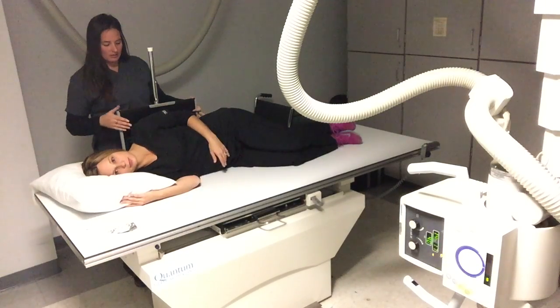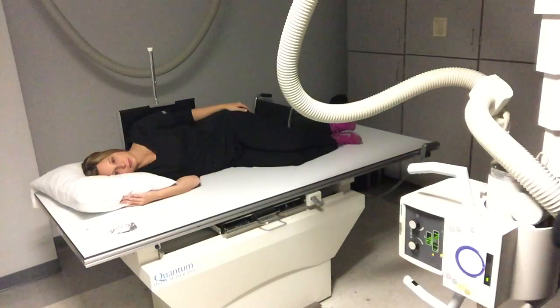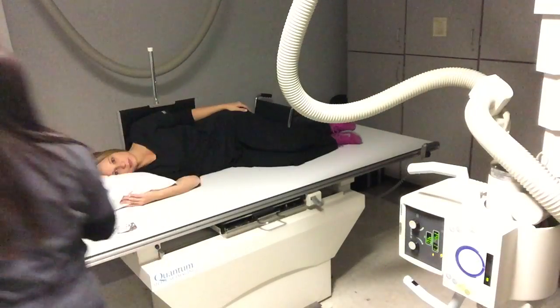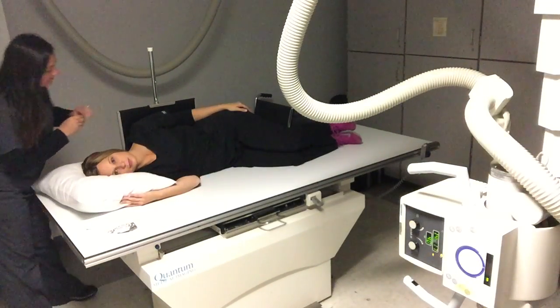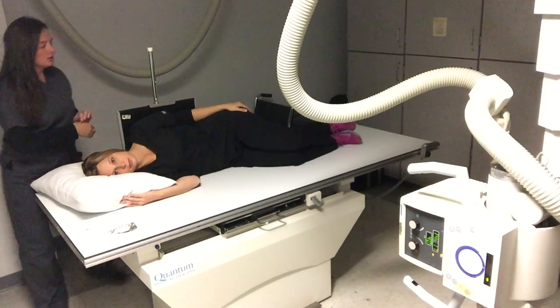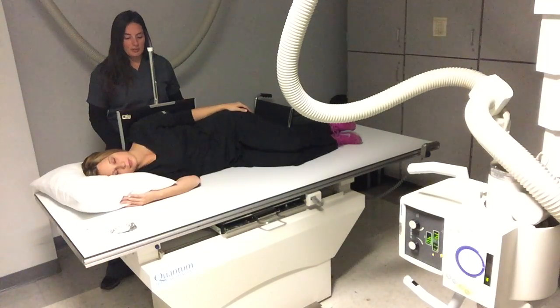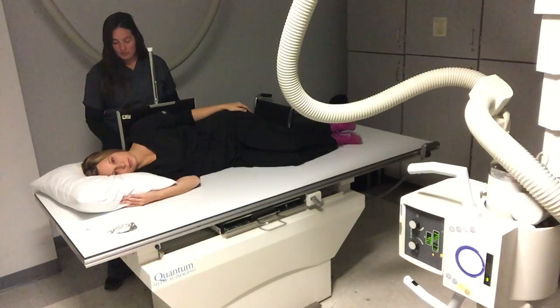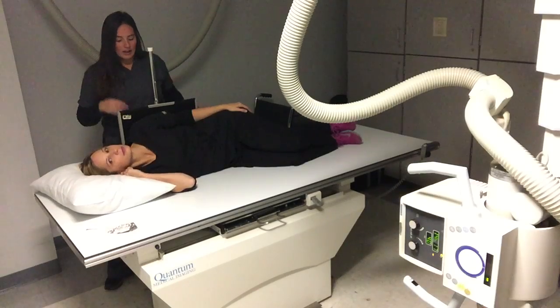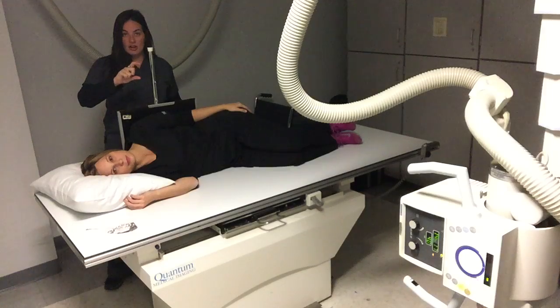While I'm back there I'll go ahead and put a marker on it — I'm going to put a left marker up here at her left shoulder. Now, typically you would also have some sort of a hard pad underneath of them, raising them up off the table a little bit, because we can't get our cassette low enough to capture the bottom part of her lung field.